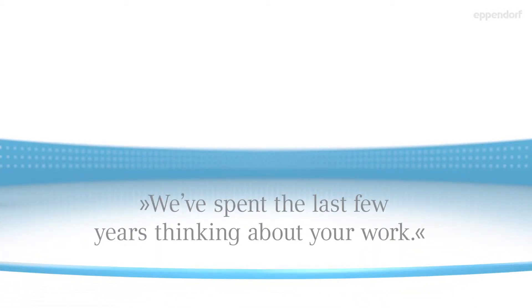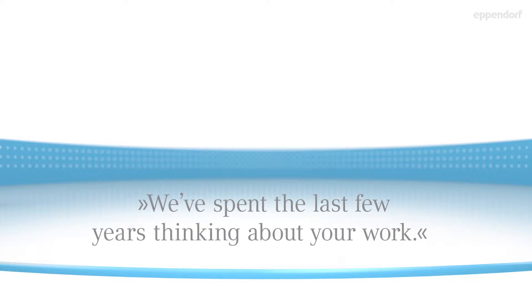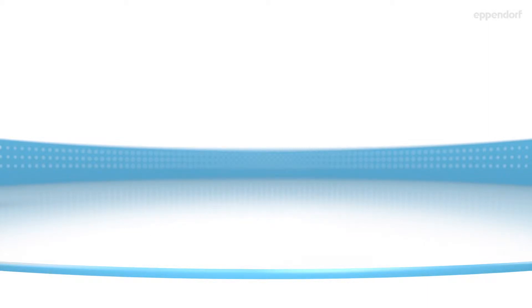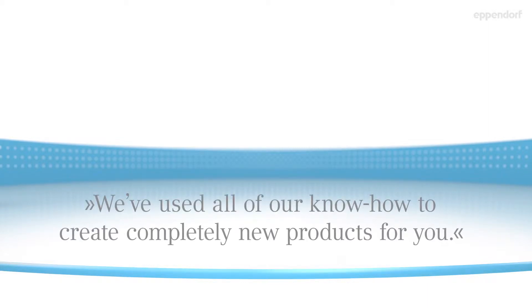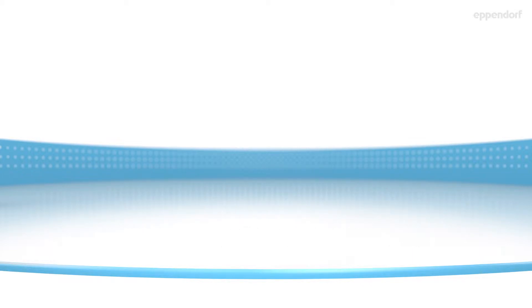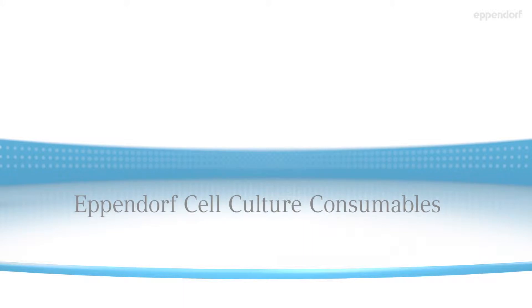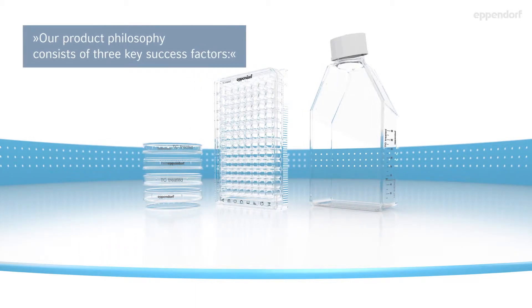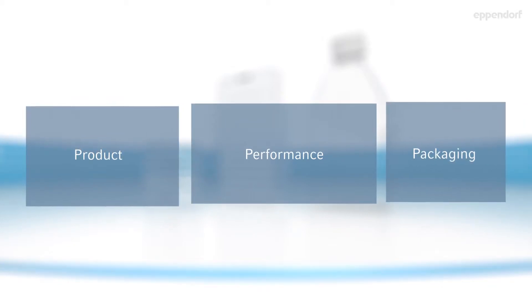We've spent the last few years thinking about your work. Now we feel at least as crazy about cells as you. We've used all of our know-how to create completely new products for you. Eppendorf Cell Culture Consumables. Our product philosophy consists of three key success factors: Product, Performance, Packaging.